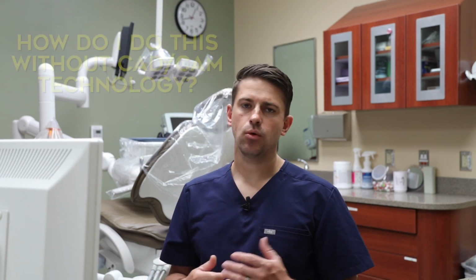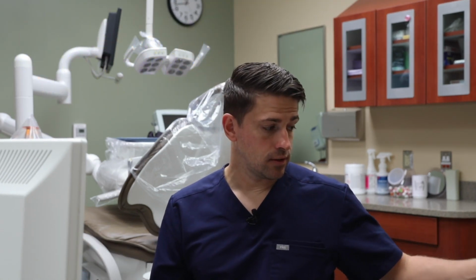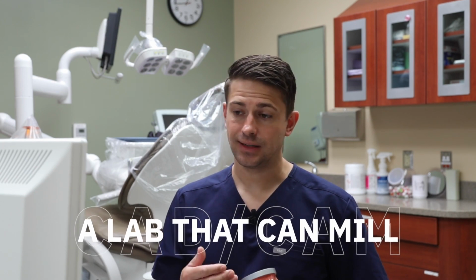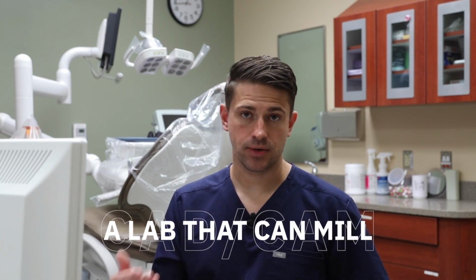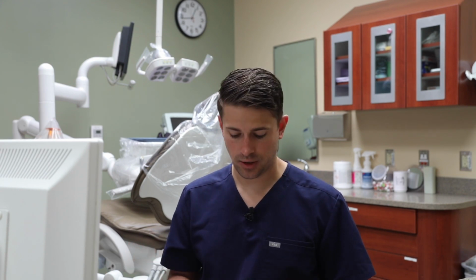You may be asking, okay, how would I do this if I don't have CAD-CAM technology? Well, again, you could take a dentiform, you could prep the tooth, you could do a PVS. My recommendation would be that you send the actual impression, or if you're doing digital scans, send that to a lab who can either mill restorations or at least be extremely consistent in the restorations they fabricate. It would be better if they could mill restorations. That tends to be a little cheaper because if they're having to stack porcelain by hand, things like that, it's going to take forever, okay?